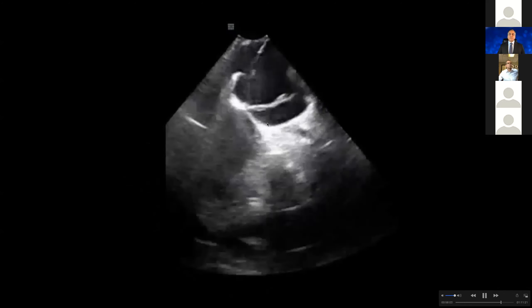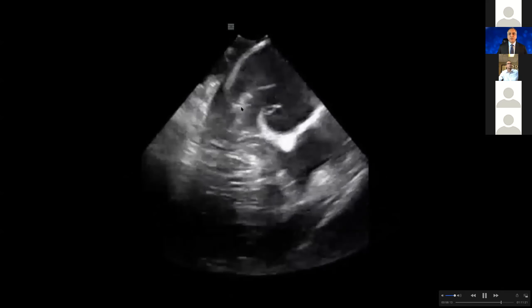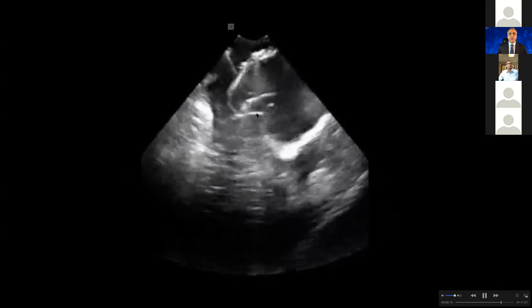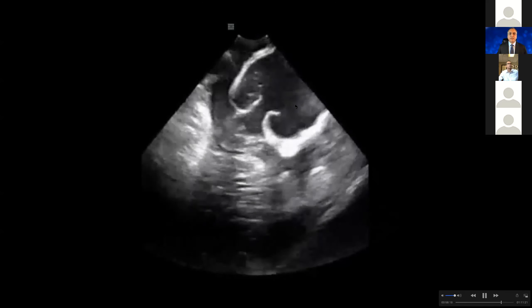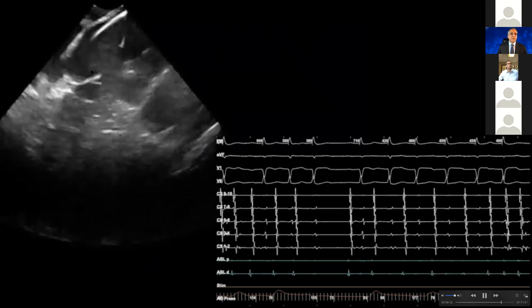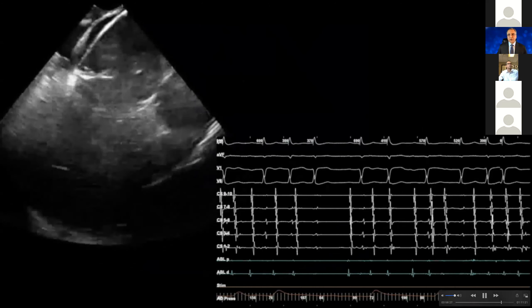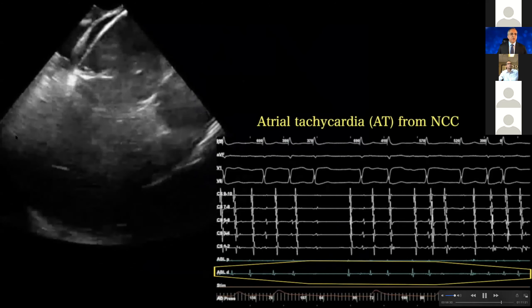Next you are going to see the ablation catheter actually in the non-coronary cusp, which, as we know, is the area where atrial tachycardia can originate. So this was actually a patient with atrial tachycardia coming from the non-coronary cusp. You can appreciate that the ablation catheter is inside the non-coronary cusp. This is the ablation catheter and this is atrial tachycardia. We were very early on the ablation catheter, and as soon as we started burning, the atrial tachycardia terminated into sinus rhythm.